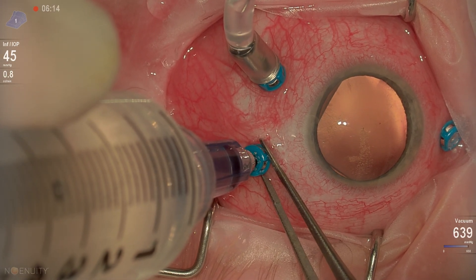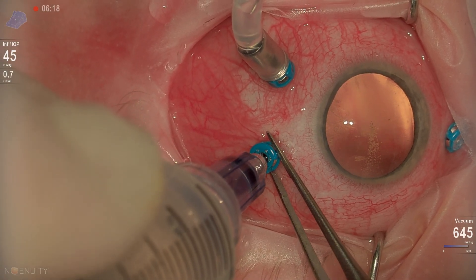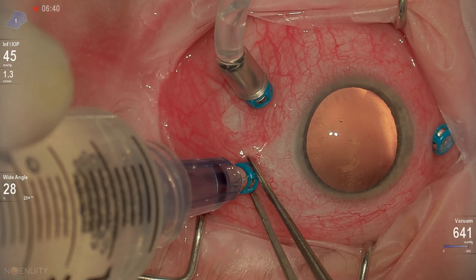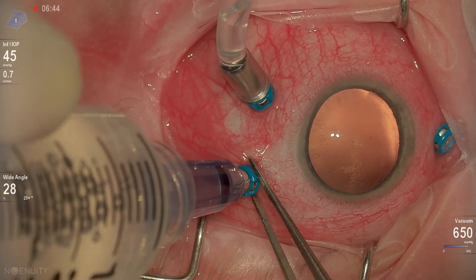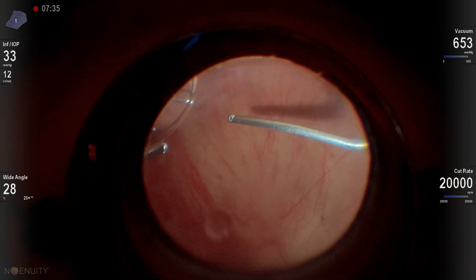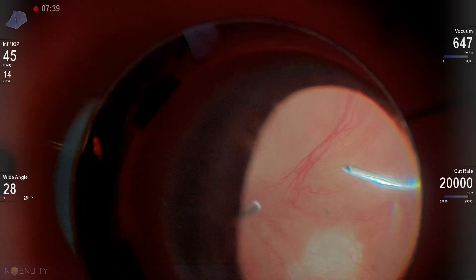When it gets to this point, you want to really be careful because if you keep your foot fully on the pedal and you're not ready to come off of the extrusion vacuum force, you can get some flattening of the eye. Follow that oil bubble down. You want to be able to follow that oil bubble. Don't come in and out — you want to try and keep that oil bubble as one single oil bubble. You do that by kind of following it into that VFC cannula, even when you can't see it in contact.